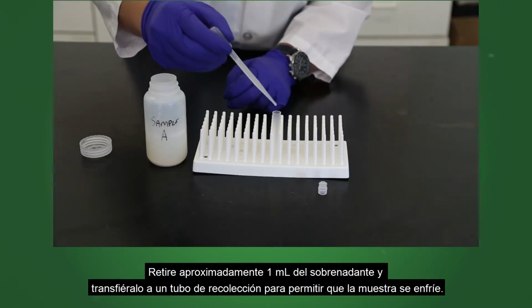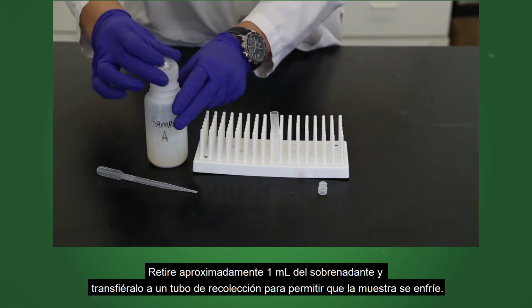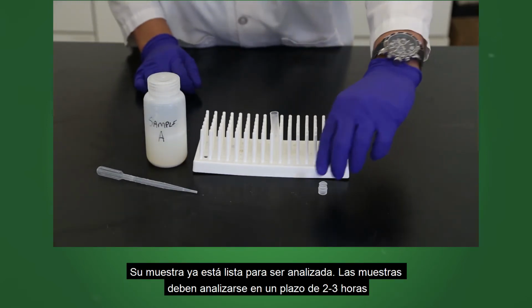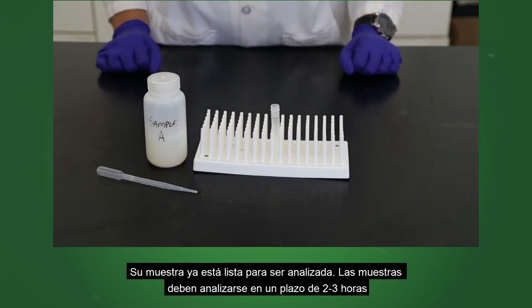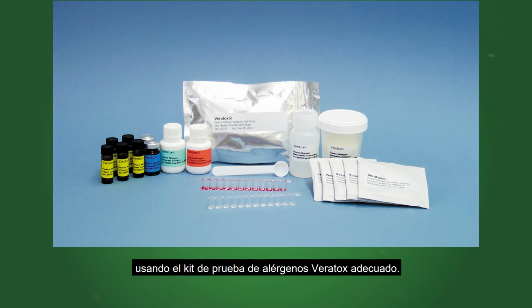Remove approximately 1 milliliter of the supernatant and transfer to a collection tube to allow the sample to cool. Your sample is now ready to be tested. Samples should be analyzed within 2 to 3 hours using the appropriate Veratox allergen test kit.